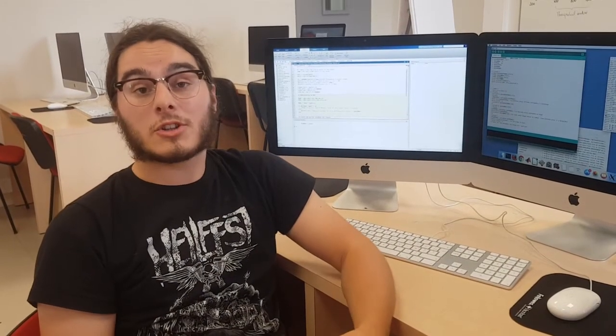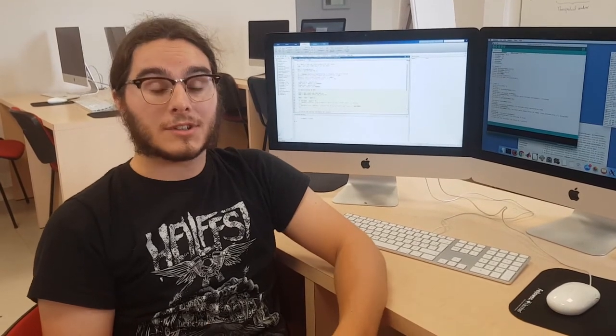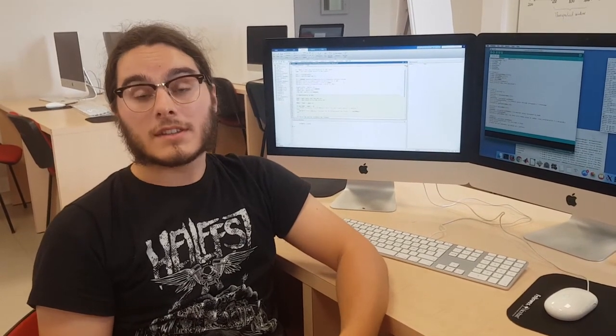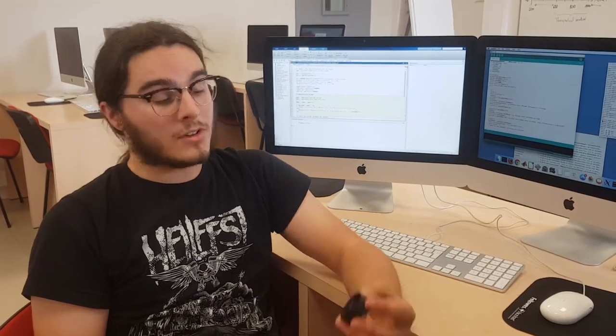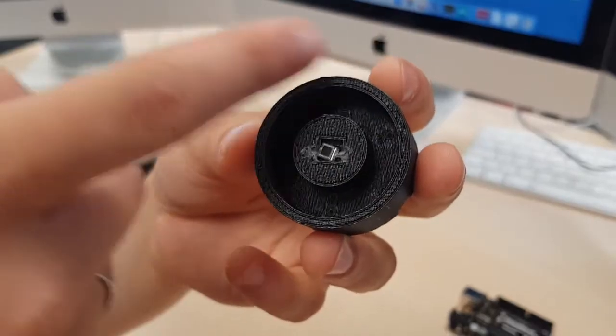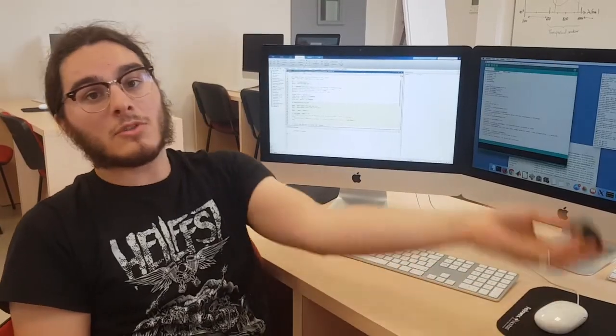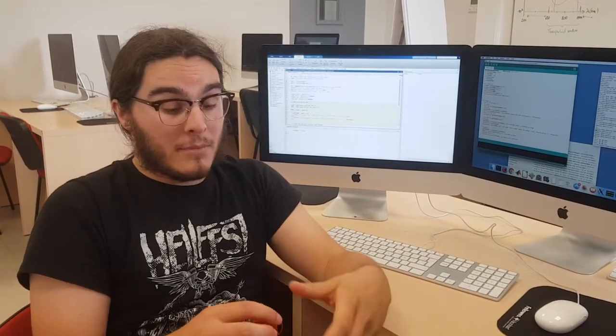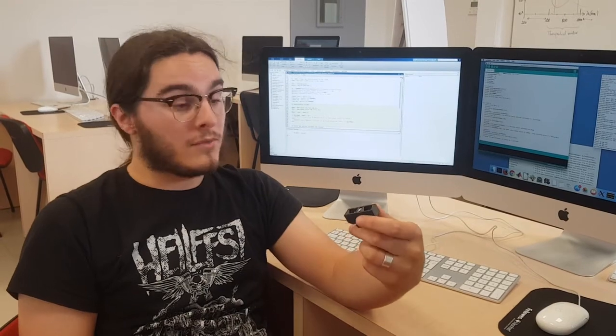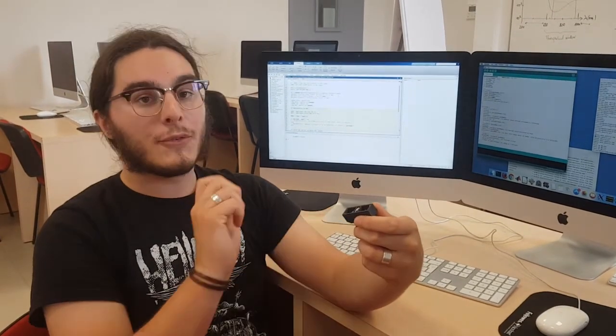For the hardware, we needed a compact device optimized so the signal we get is clean and treatable. We first tried this kind of shape: six LEDs on the outside and the photodiode in the middle. But it wasn't ideal. So we came up with this 3D-printed device, with two LEDs on each side and the photodiode in the middle.